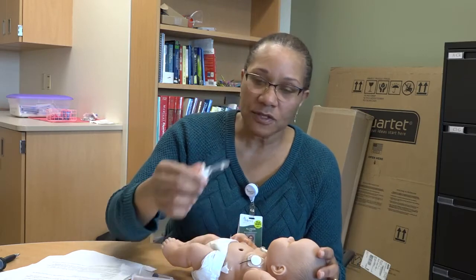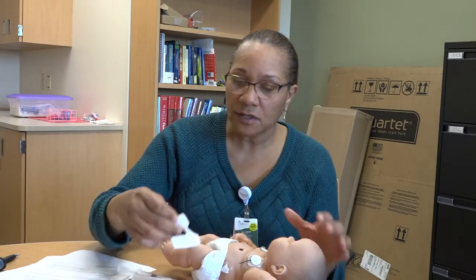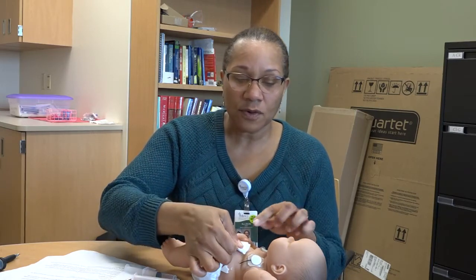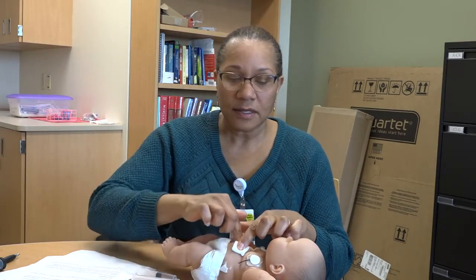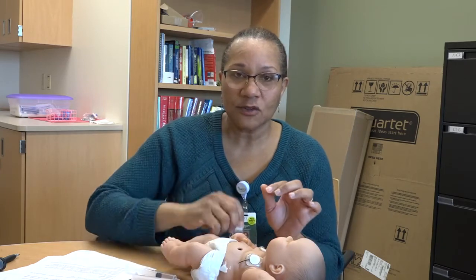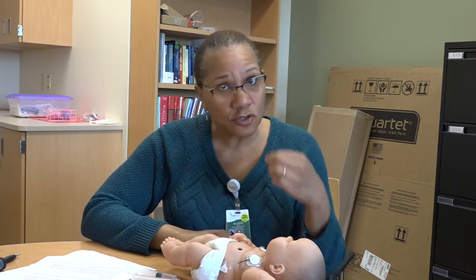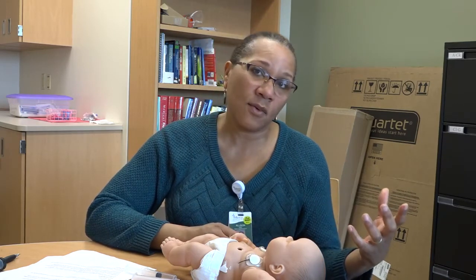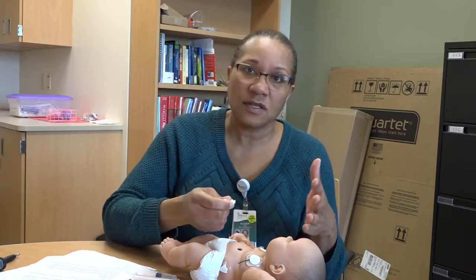So if you notice that this tube has come out, all you need to do is take a 2x2 and fold it, put it over the stoma, tape it, and drive yourself safely to the hospital, okay? It is not necessarily an emergency, but it is urgent that you get here. In the first 3 months, while that tube has not matured, it can start to close within an hour. So, like I said, it isn't an emergency, but it is urgent that you get here.